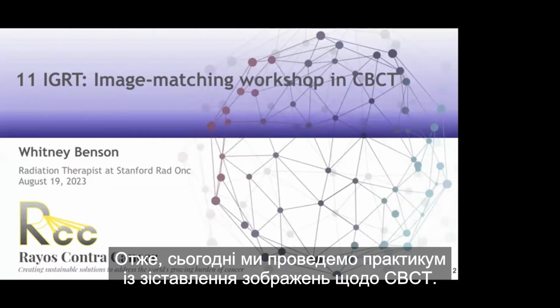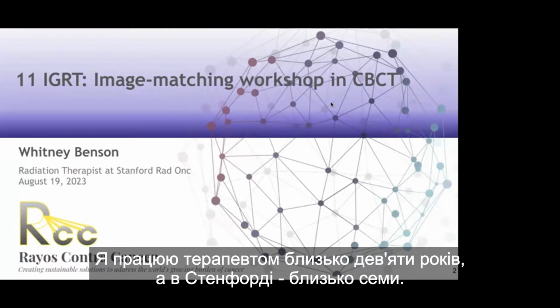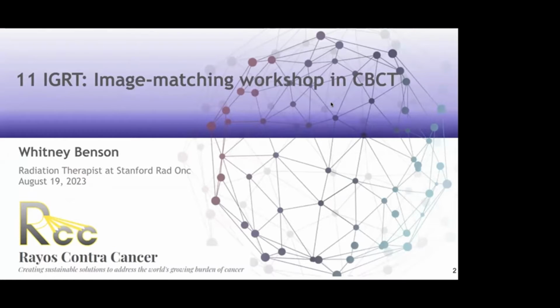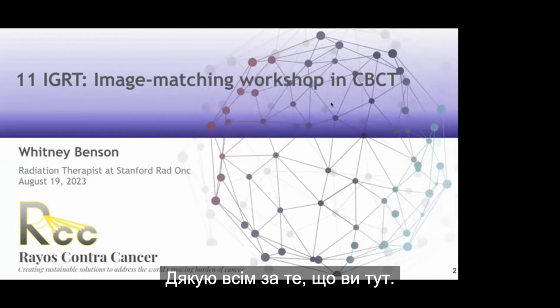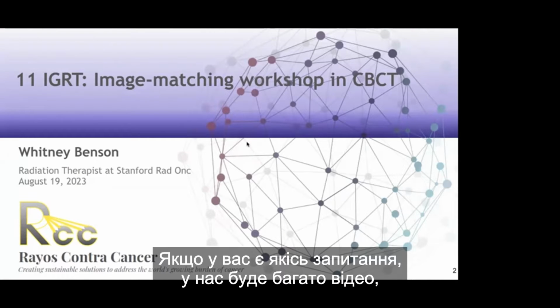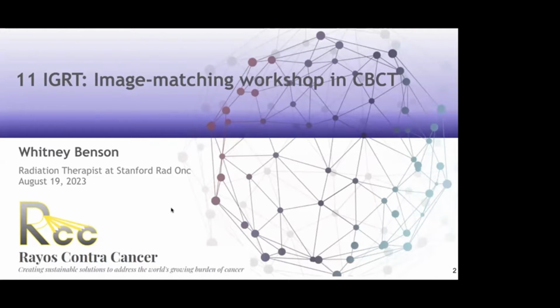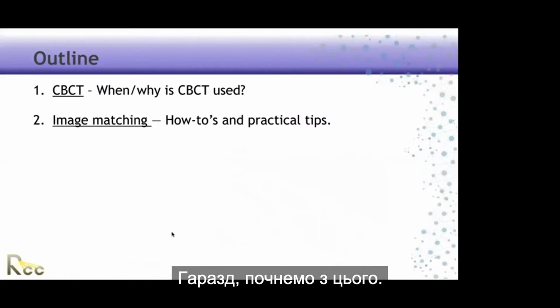Okay, so today we're going to be doing an image matching workshop in regards to CBCTs. I'm Whitney Benson. I'm a radiation therapist at Stanford. I've been a therapist for about 9 years and at Stanford for about 7. Thank you all for being here. I hope this is helpful. Please ask any questions if you have any questions at all. We're going to have a lot of videos to go over a lot of things. Okay, so we're going to get started here.